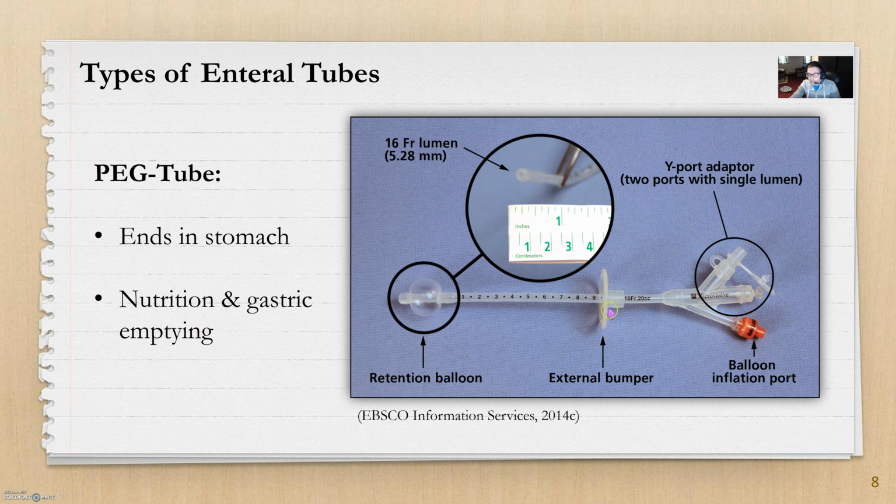So as I referred to in the Mickey button, this end of the catheter, the outside portion that's outside the stomach, usually isn't here, and it's just a little button with this little anchor here, and you just hook the tube up and feed. So it's just a more discrete way to do things. It cuts off this end part, which can be a little obtrusive if you're out and about. That would be more of a solution that you would have for long-term feedings.